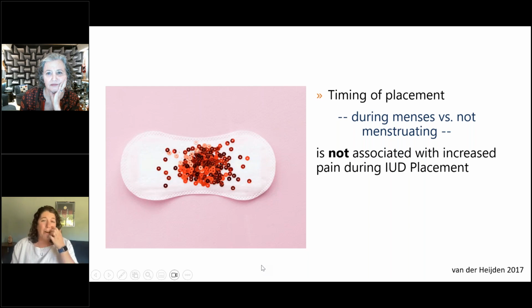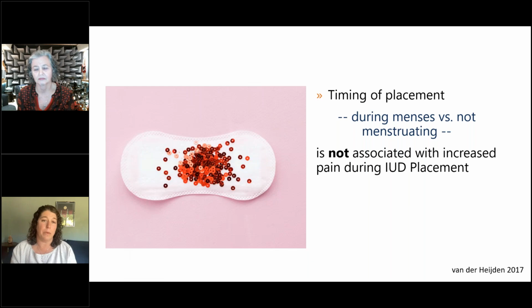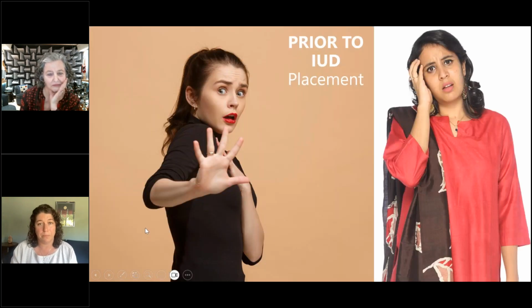One thing to note, often in my own practice, when I'm training providers or talking with my colleagues, some people think that either doing the procedure during someone's period or not doing it during someone's period can impact the client's experience of pain. But in the studies that we have, it's not been associated with any increased pain during the IUD placement, whenever we're doing it during the cycle.